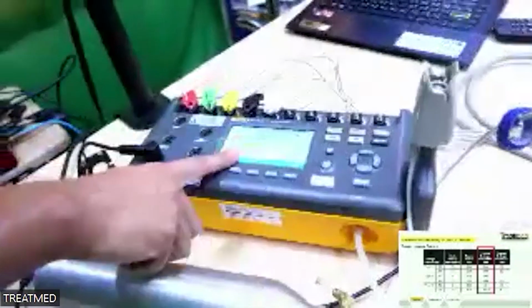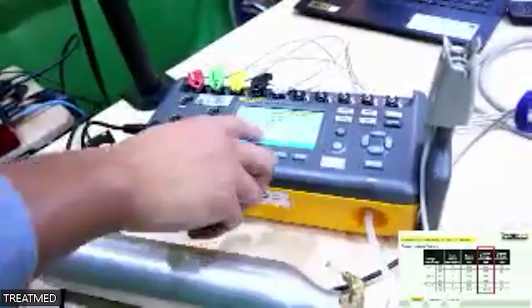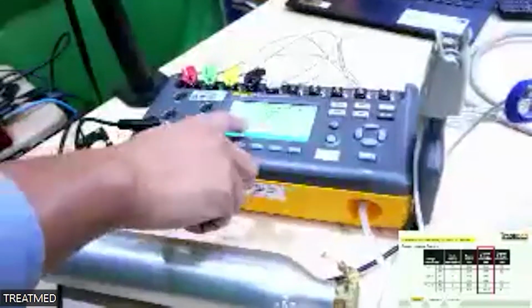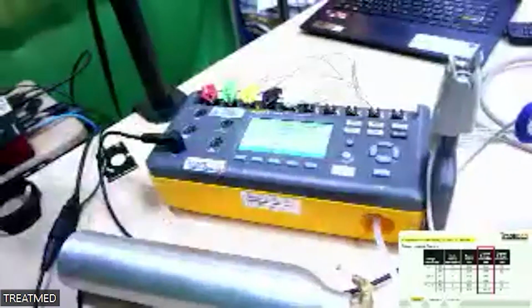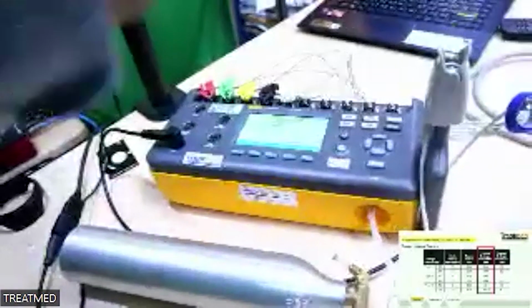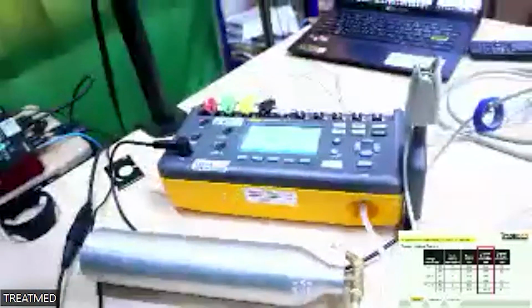And then I try in the simulation, we have the envelope shift. The envelope shift is the value for shifting the sensitivity of the sensor in the patient monitor.